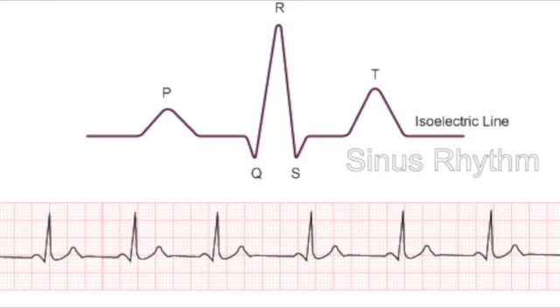We know that there's a P wave before every one, so we know it's sinus. Now we know that the rate seems to be within the normal range. So I think we would say normal sinus rhythm. So normal sinus rhythm would be our interpretation of this one, at least with this one lead we're given, correct? Yes, and typically, that's what we're hoping, because that tells us that our conduction is coming down the heart the right way, right?